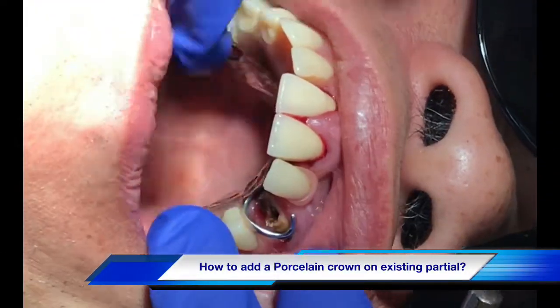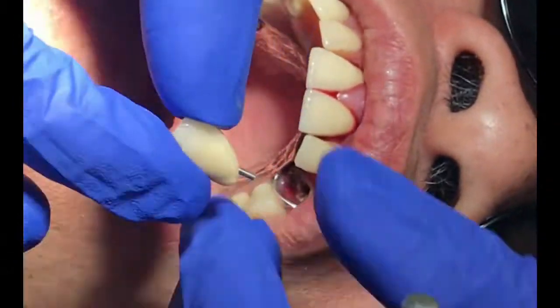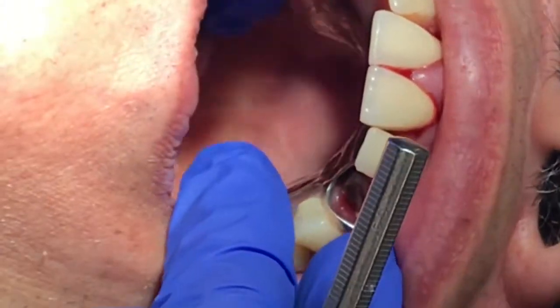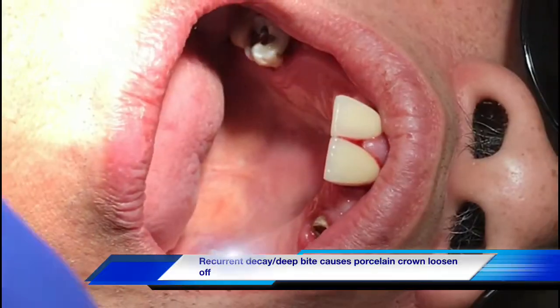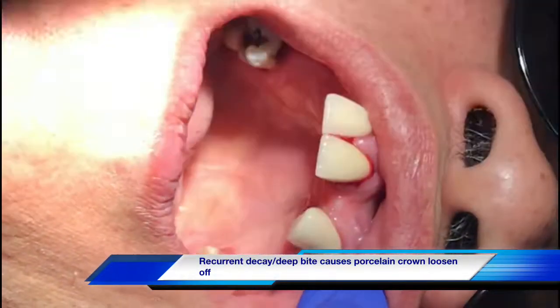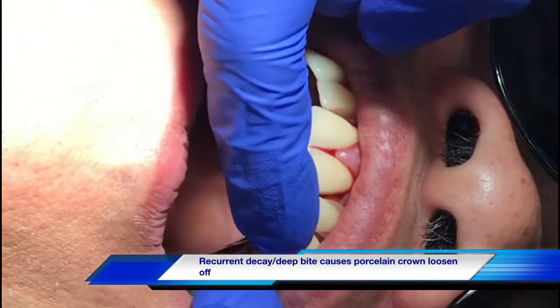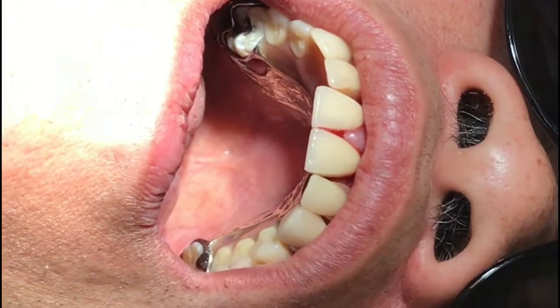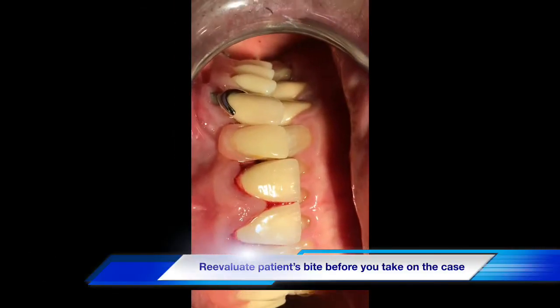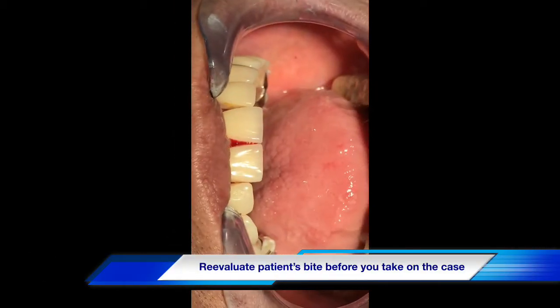Hi everyone, take a look at this situation. Your patient comes in — he or she broke tooth number 11, with the post inside the crown, and you need to evaluate what you should do for this case. How do you handle this? Before you start the case, evaluate the bite. In this particular case, the patient has a very deep bite.